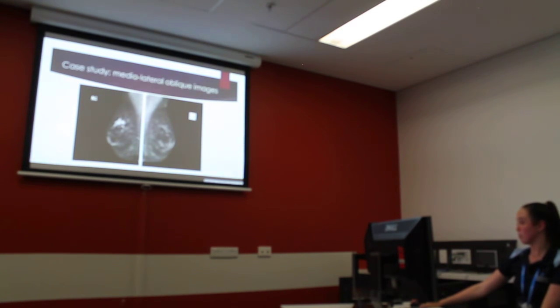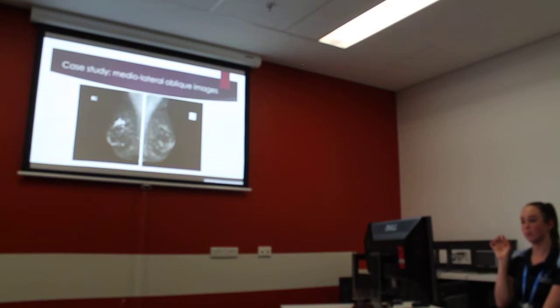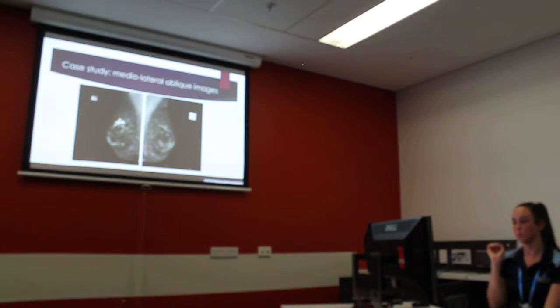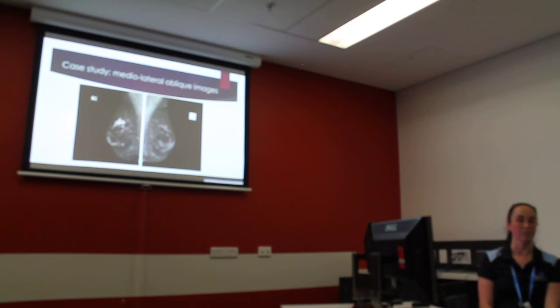It is also demonstrated in this projection that there is thickening of the nipple and there's a bit of skin retraction. So it's been noticed that this skin retraction occurs when the cancer spreads into the ducts and it pulls basically the glands inwards, causing that effect. Generally, when this occurs, the cancer is invasive and aggressive.